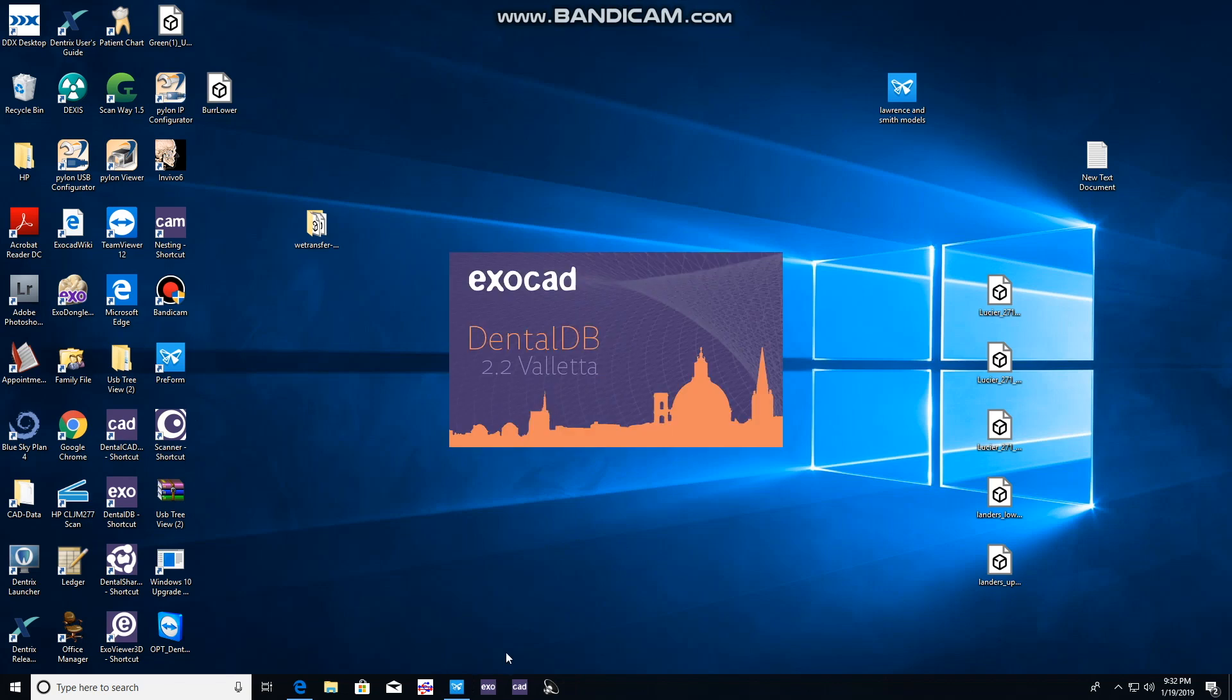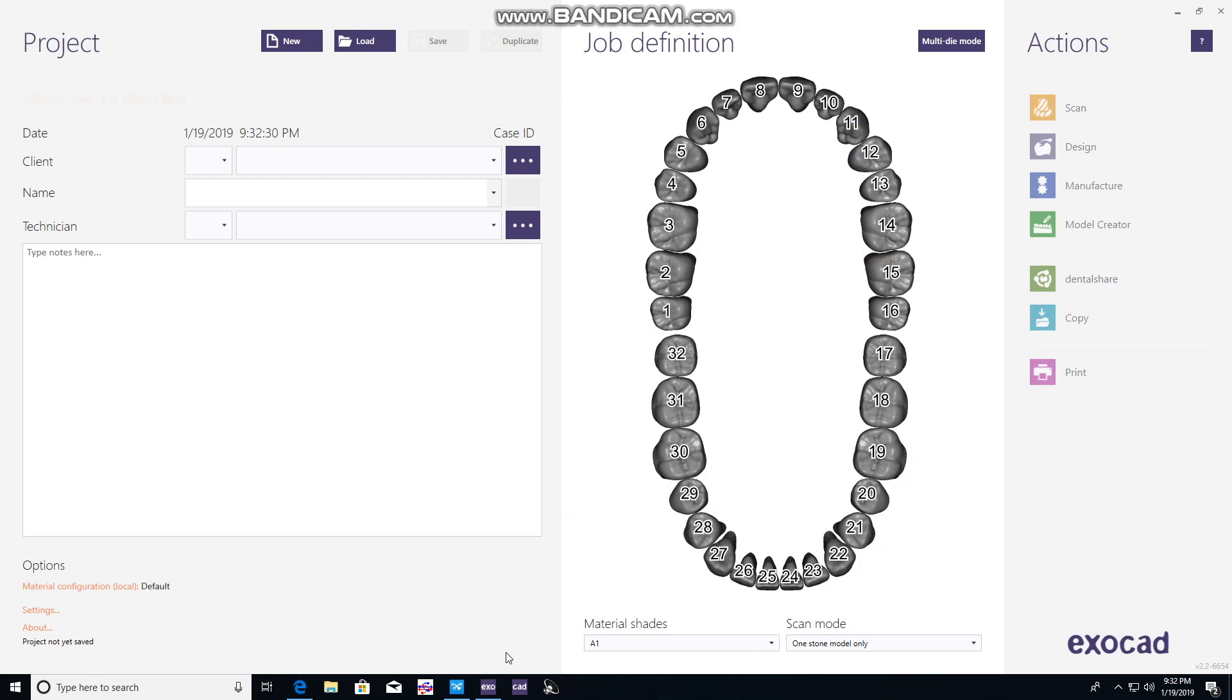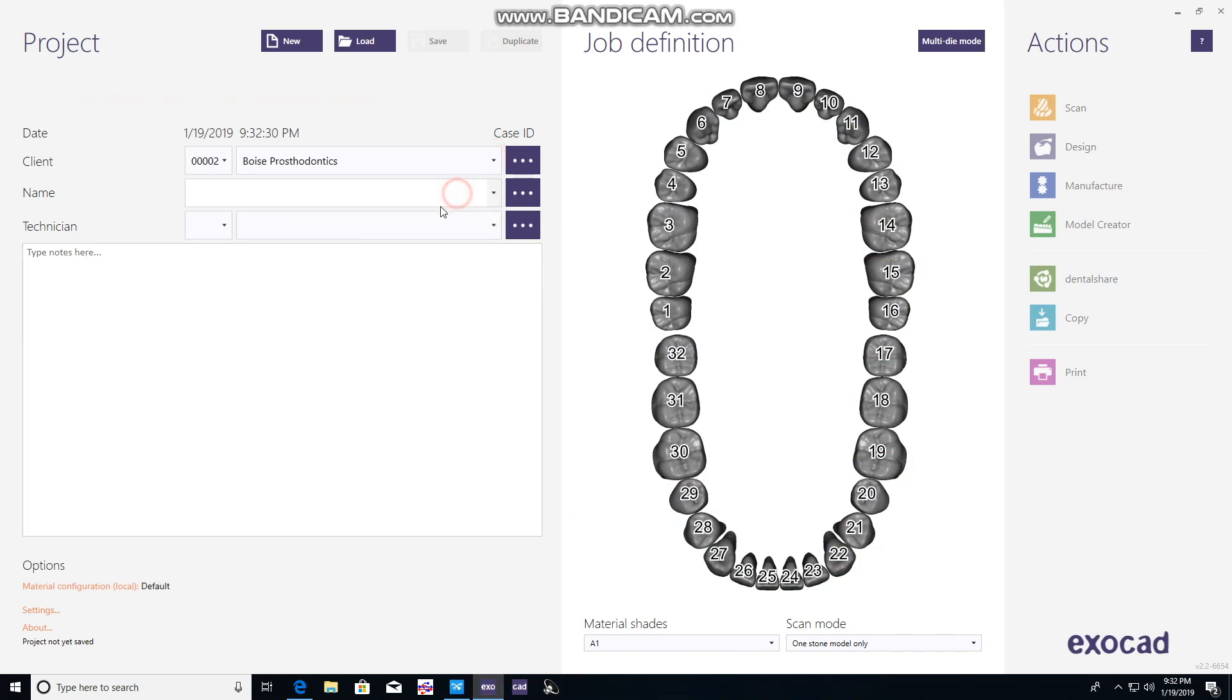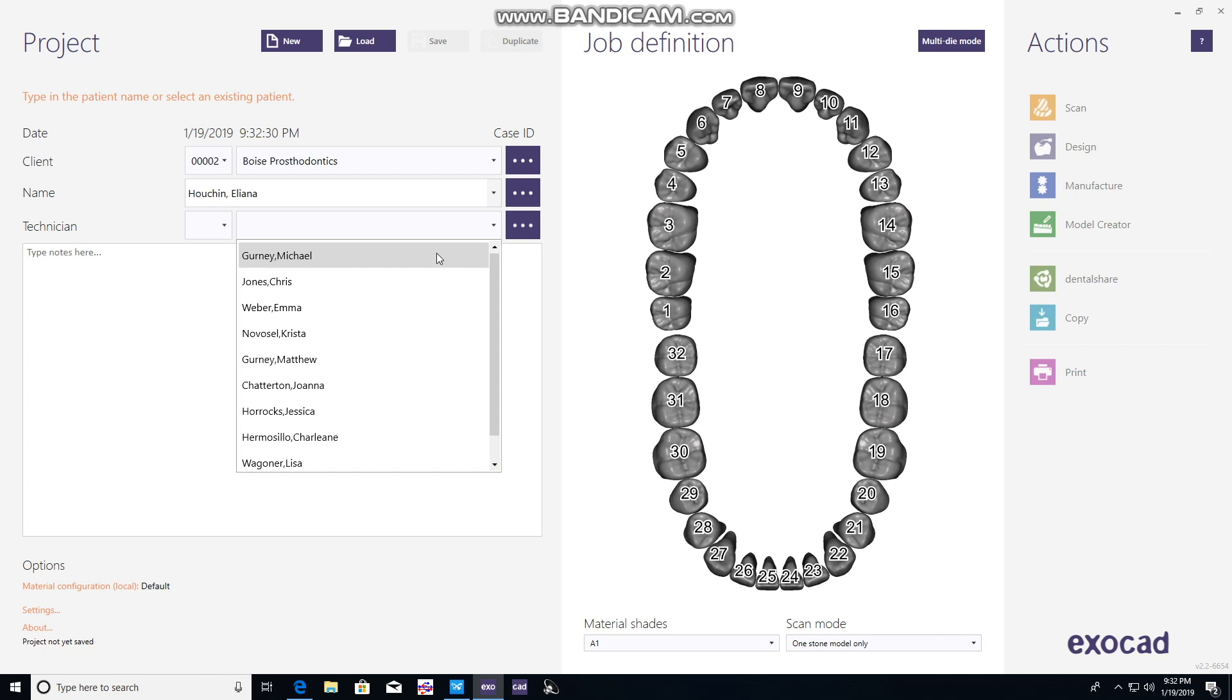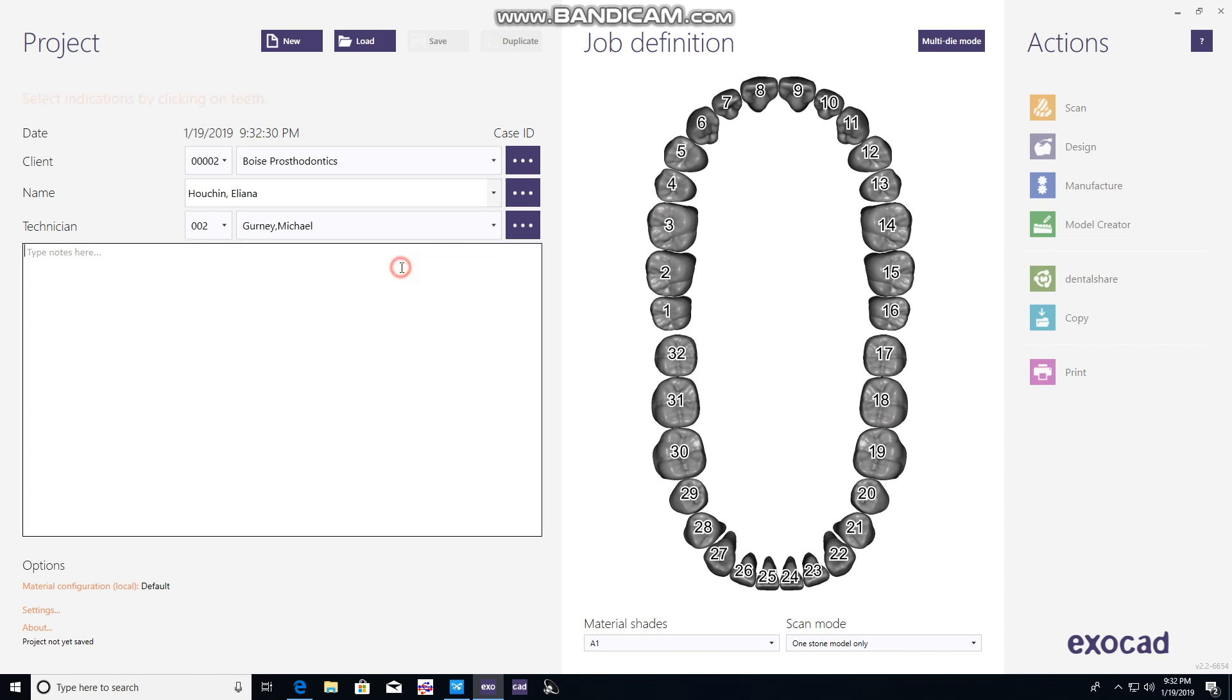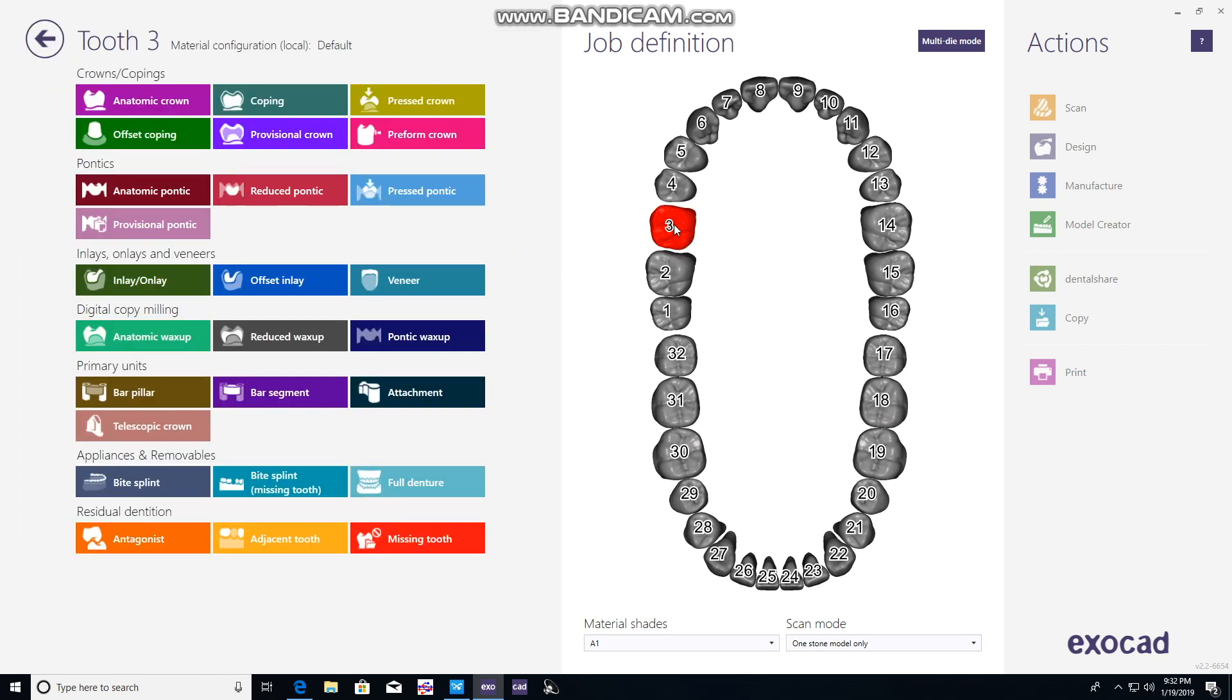We'll open the ExoCAD software, click on the lab we're working with, put in the patient's name, and select the technician that'll be working on the case. In this case, it was myself. I clicked on myself and put in a couple notes. You don't need to do this, but it's fun to help us remember what we're doing.